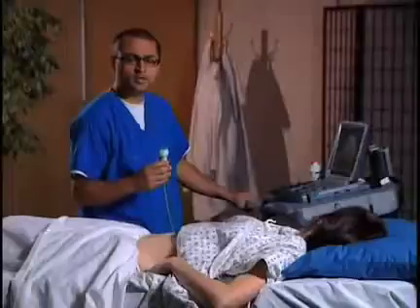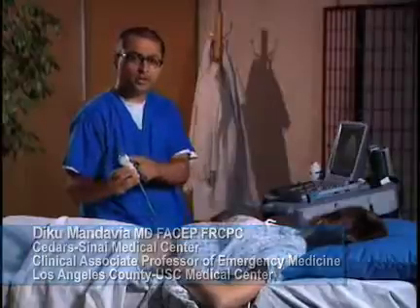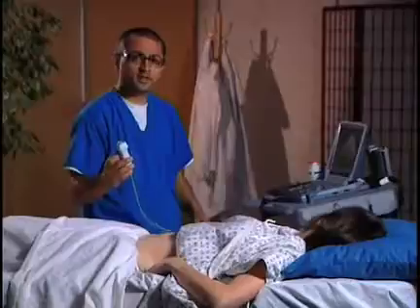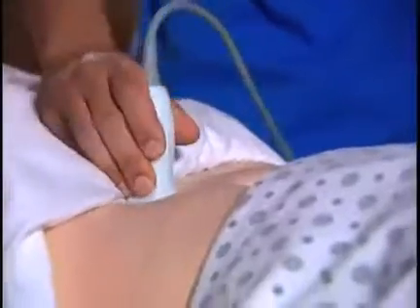We're going to do the FAST exam, the pelvic view in a female now. Again, we have the phase array transducer. Here's a probe marker right here. We're going to start off with a sagittal view, and ideally the bladder is full. So we go just above the symphysis pubis.